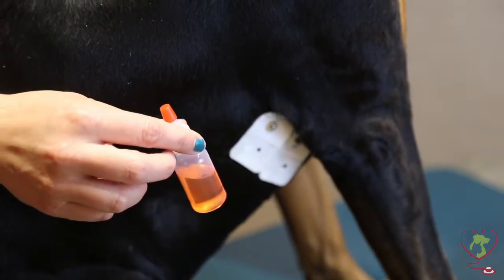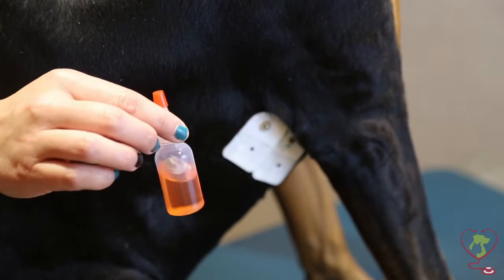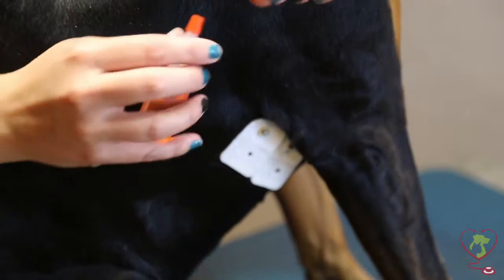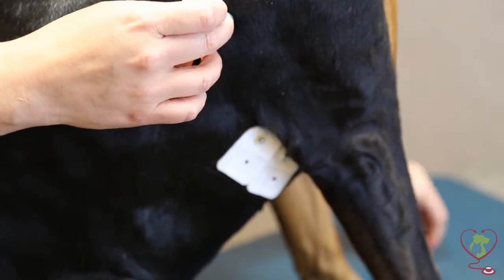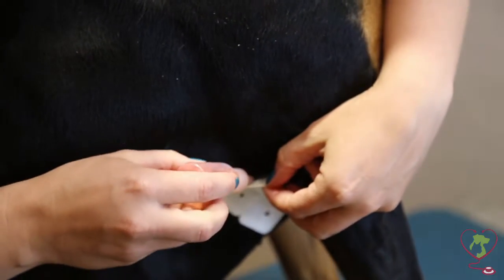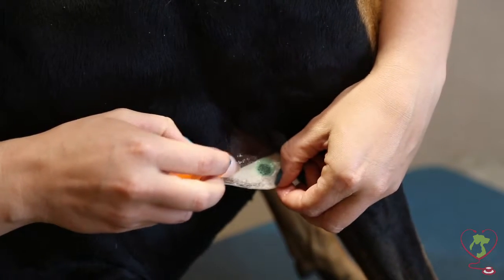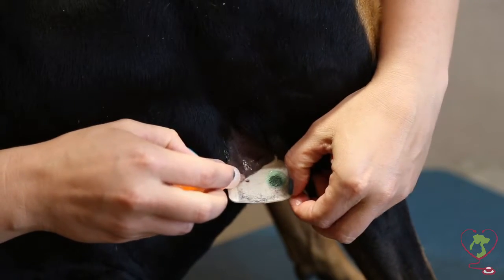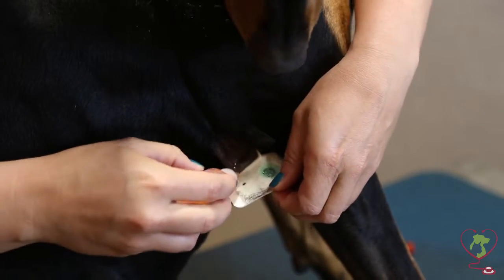Now we're going to remove the electrodes. To do this, you'll want to use Detach-All, and we'll send that home with you when we apply the Holter monitor. It's kind of like Goof Off — you just want to stick it between the patch and your dog's skin and work it down gently. You can see that's coming off real nicely. Do this until you get all the patches off on both sides.